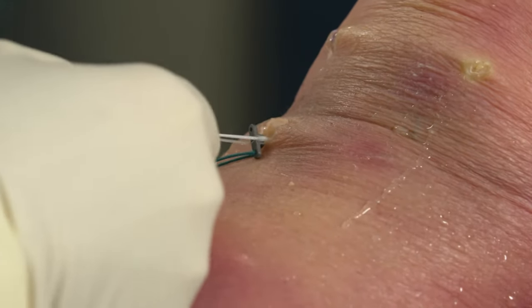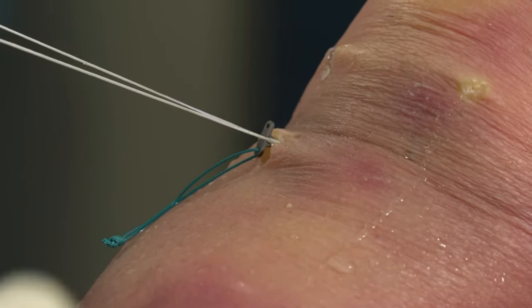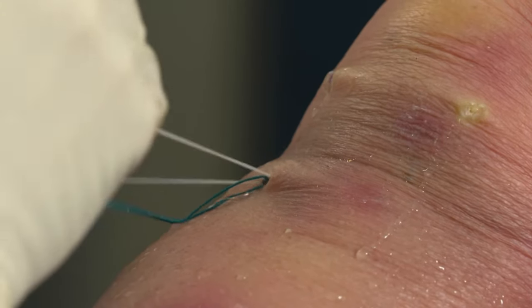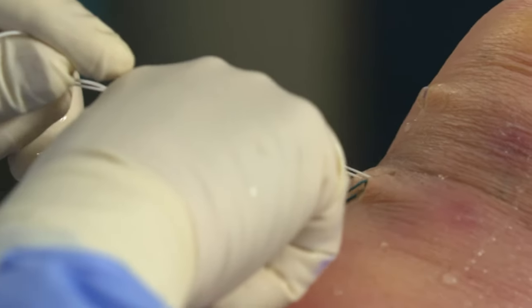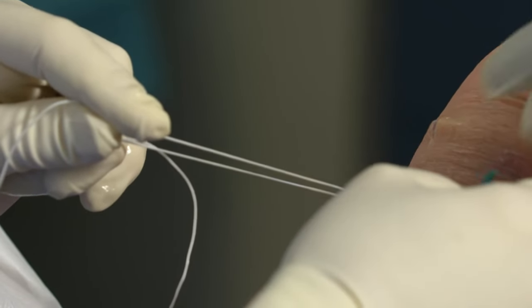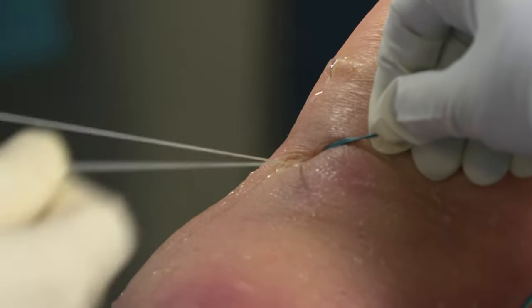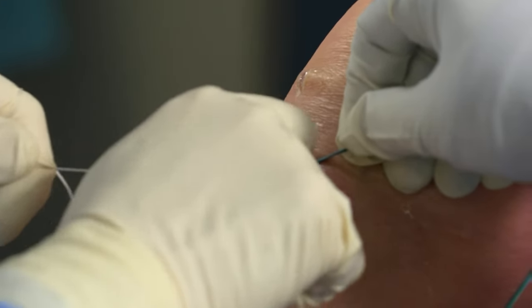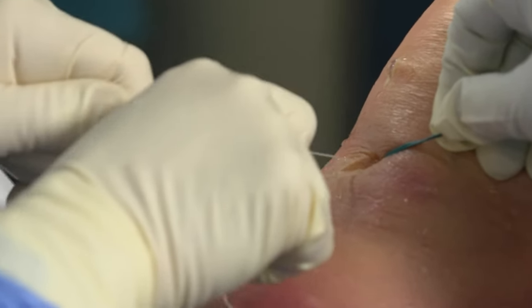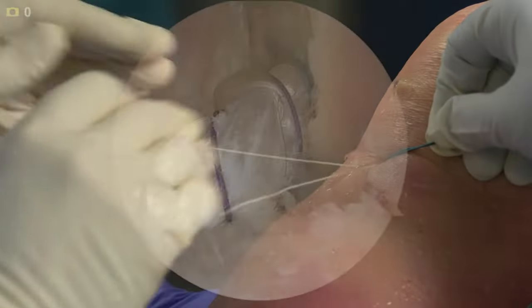So again, I have it at 20 degrees posterior drawer applied, and then I tighten it down. You can gently hold this so that as it tightens down — now I'm fully seated against the tibia. I'm giving it some really hard pulls and you feel the sutures sort of bouncing back and forth once you've maxed out on the knot. And that's it.